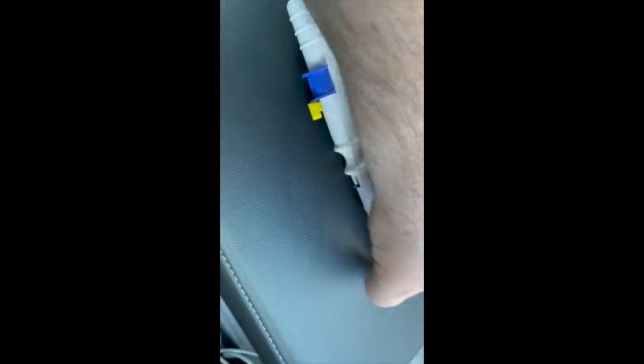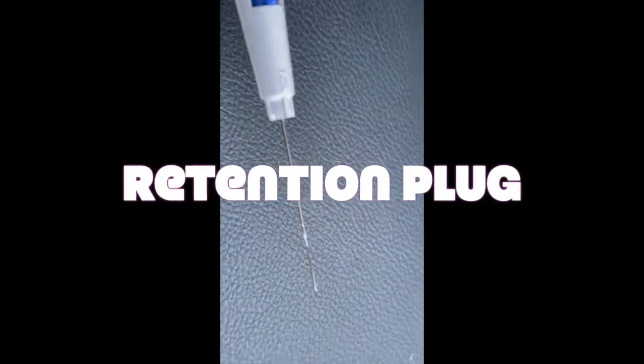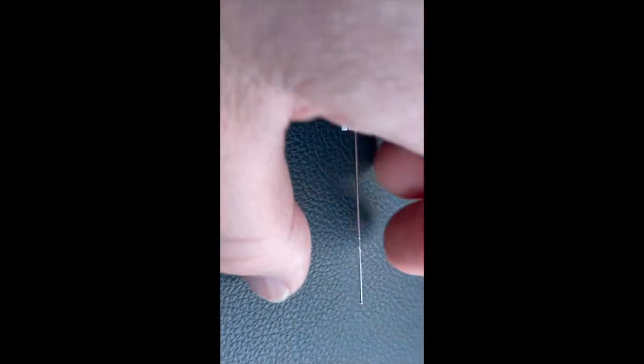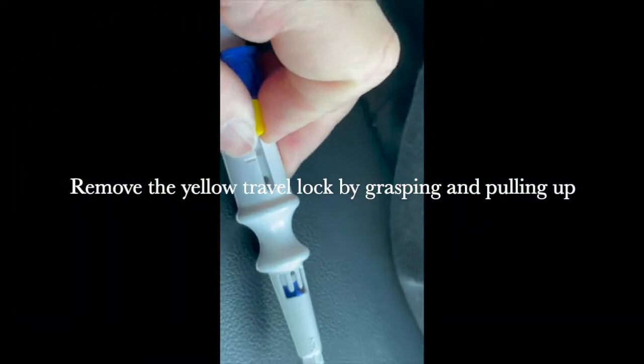Removing the needle cap exposes the retention plug, which is just another device that prevents the Zen from falling out of the tip of the needle during transport. Once the retention plug is removed, it's important to keep the tip of the needle facing upwards to prevent the Zen from falling out of the tip of the needle.